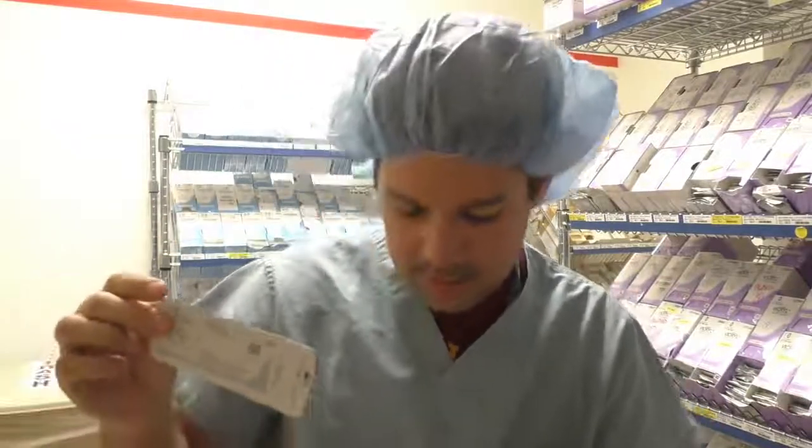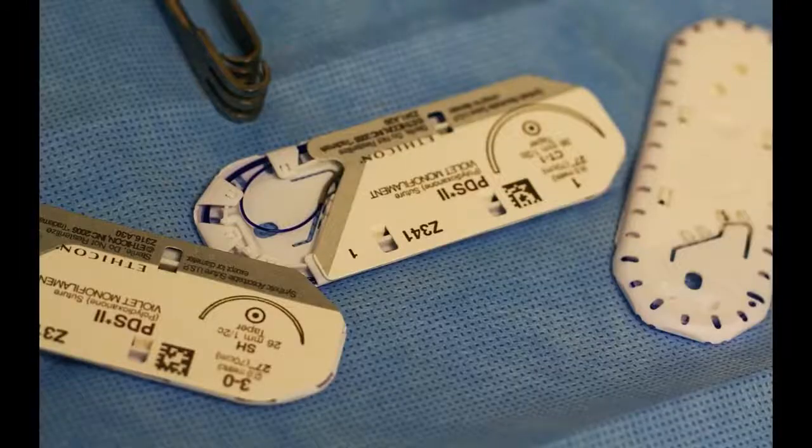Fourth suture I have for you guys is the PDS. PDS suture is interesting. It's absorbable, it's monofilament. The packaging, as you can see, is just drab gray, and the suture itself is violet. It's a purple monofilament suture.